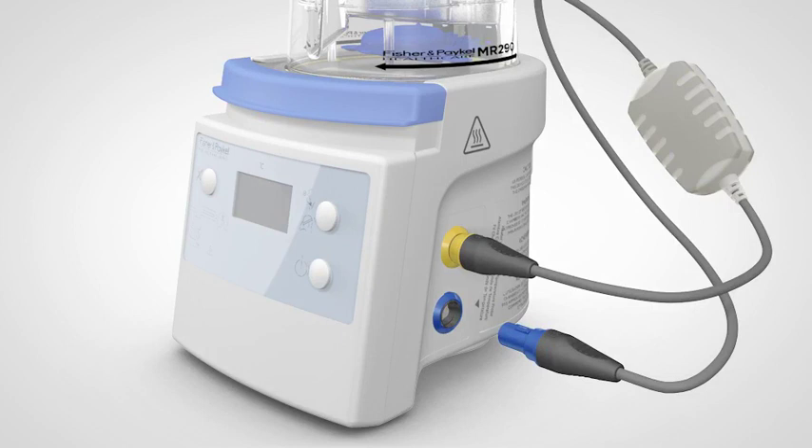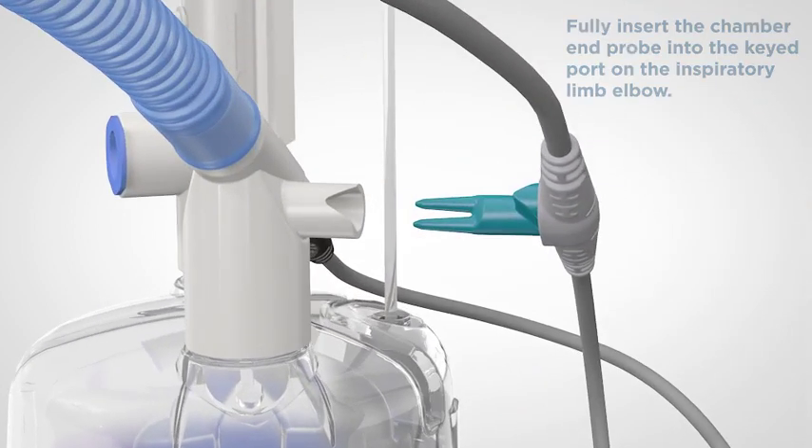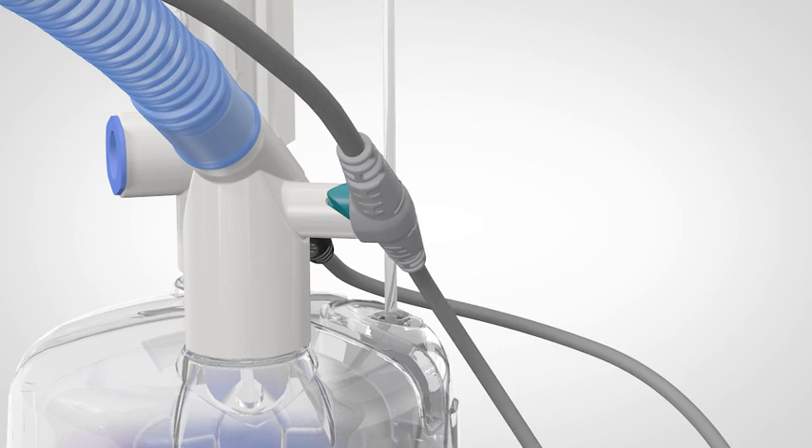Next, let's connect the temperature and flow probe. This adapter has a blue plug and is used to measure the temperature and flow of gas at the chamber and temperature of gas delivered to the patient. This information helps the humidifier control the chamber output temperature and the breathing circuit temperature to ensure optimal humidity delivery. Connect the blue plug to the blue socket — again, this socket is keyed, so you may have to turn the plug to insert it. Connect the temperature and flow probe to the port in the side of the elbow connector. The probe port includes a V-shaped notch corresponding to a V-shape on the probe — line these up and push the probe firmly into place. Infant circuits use a friction fit; it is important for correct operation that the probe is lined up with the V-notch and inserted fully.